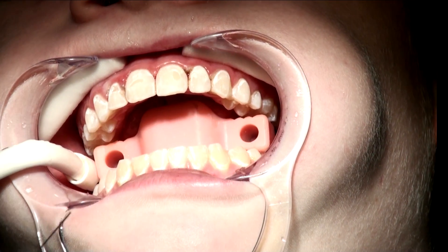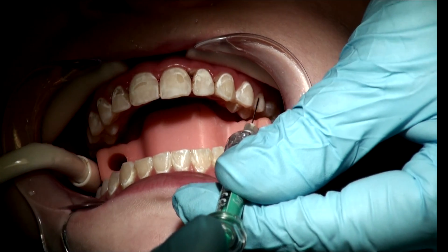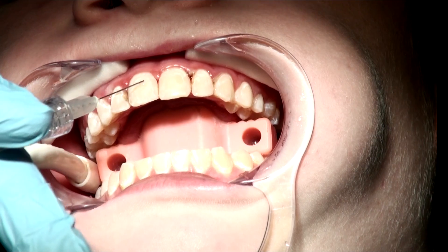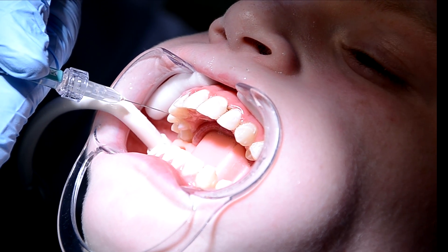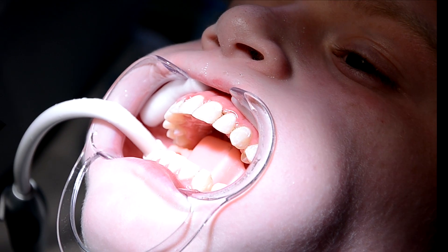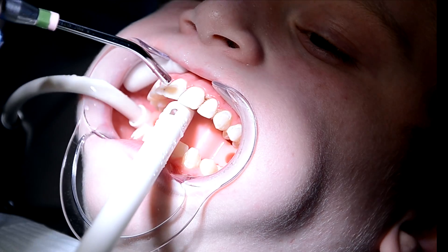After you've etched and rinsed everything dry, the Icon Dry is applied for 30 seconds. This is an ethanol, and any moisture that is in or around the white spot or lesion is pre-treated with the ethanol. Air dry the Icon Dry for 30 seconds.